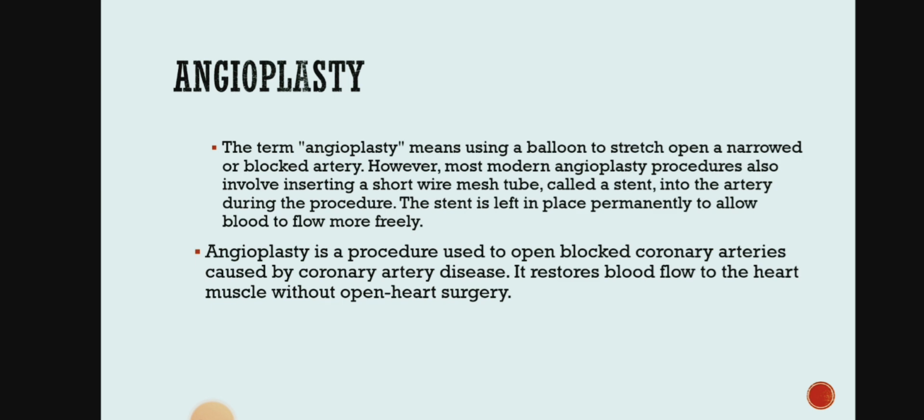The term angioplasty means using a balloon to stretch open a narrowed or blocked artery. However, most modern angioplasty procedures also involve inserting a short wire mesh tube called a stent into the artery during the procedure. The stent is left in place permanently to allow the blood to flow more freely. Angioplasty is a procedure used to open blocked coronary arteries caused by coronary artery disease. It restores blood flow to the heart muscles without open heart surgery.